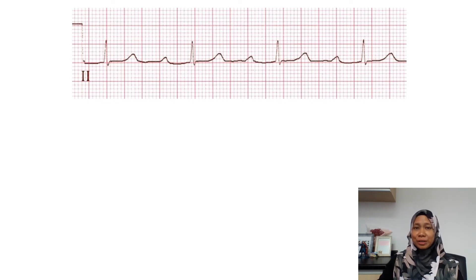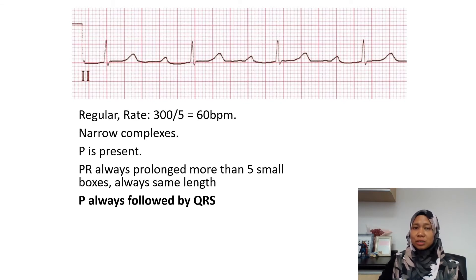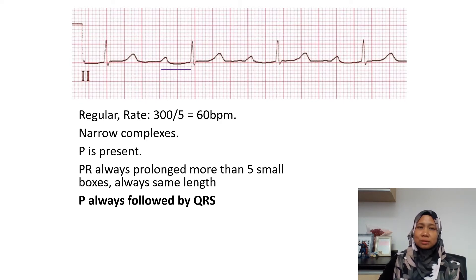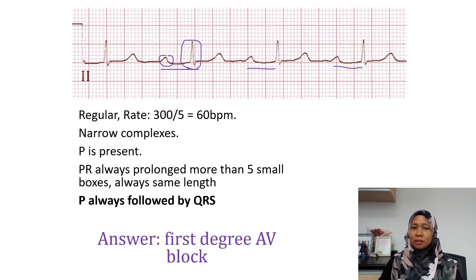So we can see that it is regular. The R-to-R interval is the same throughout the strip. And we can see it is narrow complex. The P wave is present. However, the PR interval is prolonged. We can see that the PR interval here is very prolonged — it is more than five small boxes. However, the PR interval is always of the same length, and the P is always followed by QRS complex throughout the strip.